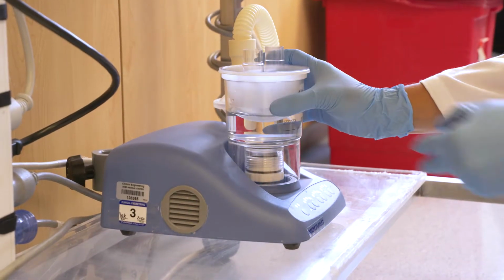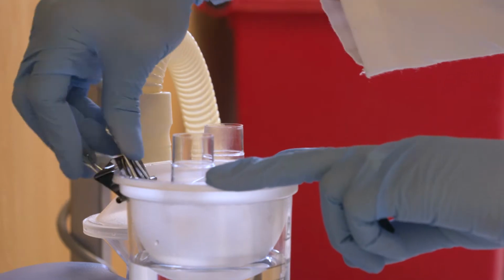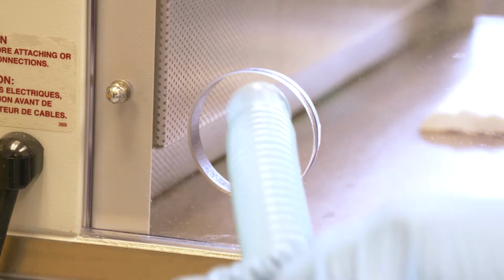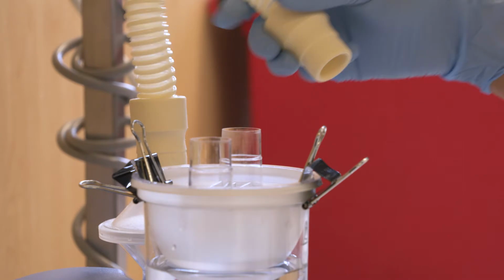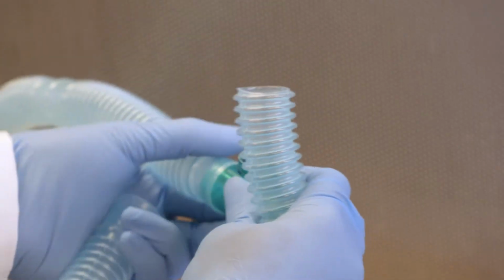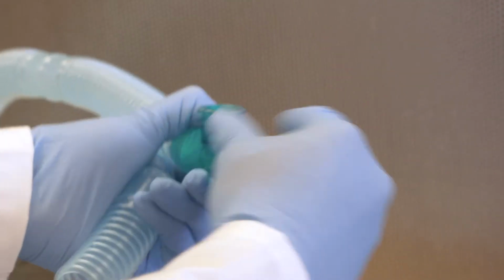Place the filled medication cup gently and firmly in the nebulizer chamber. Use binder clips to secure the nebulizer chamber. Use 7 sections of Cora Flex tubing to reach the booth. Attach the tubing to the medication cup. Attach the plastic T adapter and add 1 section of Cora Flex tubing that has been cut in half to each side of the T adapter.